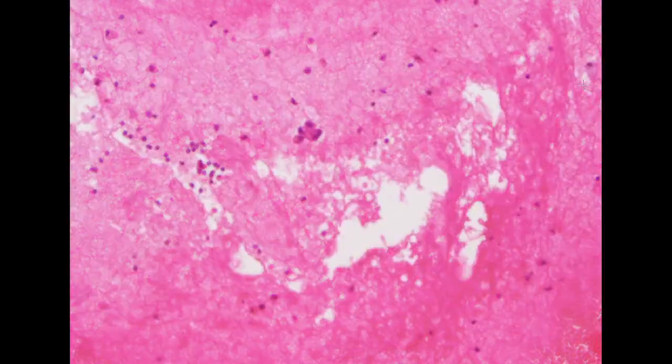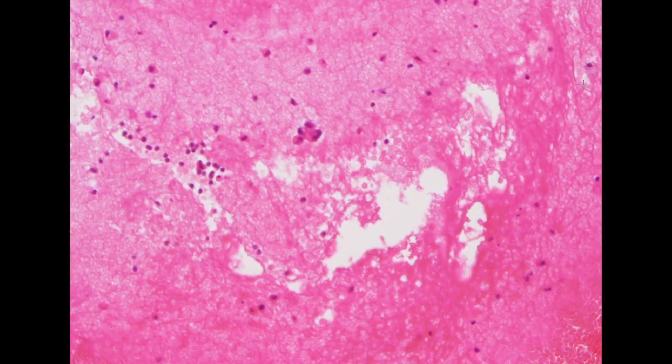So the case was initially screened as negative. However, if you go to the cell block preparation, you can also see a similar component.